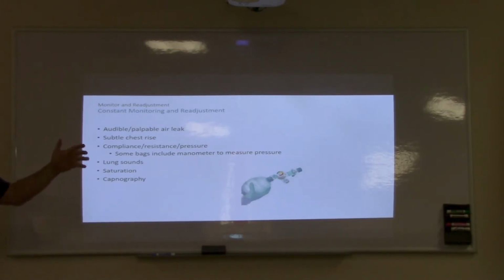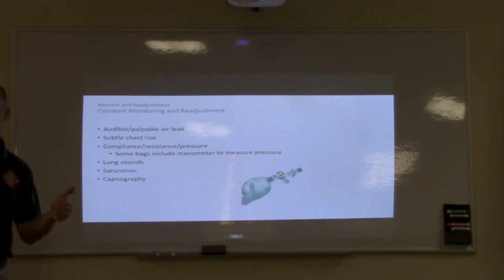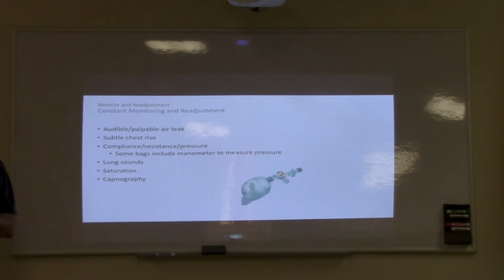Now, understood, depending on how many people show up and how chaotic it is and what's happening, that might not be your ultimate priority in the first bit. But we're also doing a non-rebreather in a lot of our patients, so positive pressure doesn't even appear for a few minutes into the code anyway. So it seems like when you start bagging should be a good time to put the capnography on.